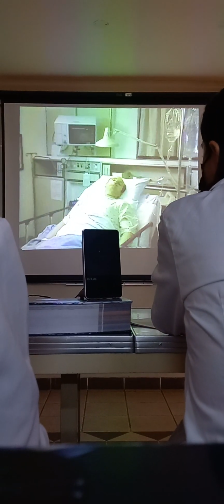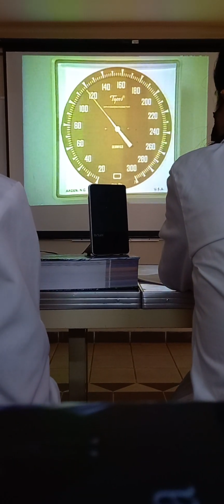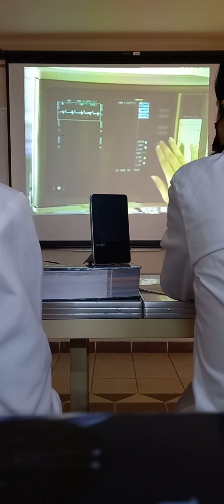When you begin work today, this man could be one of your assigned patients. His total care is your responsibility. Lab tests may be ordered. Medications must be administered. Vital signs are monitored. Another aspect of the patient's care will include continuous monitoring of his EKG.